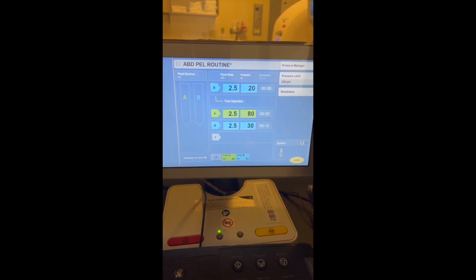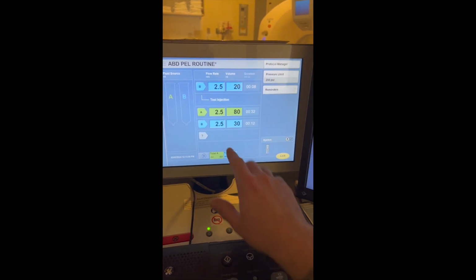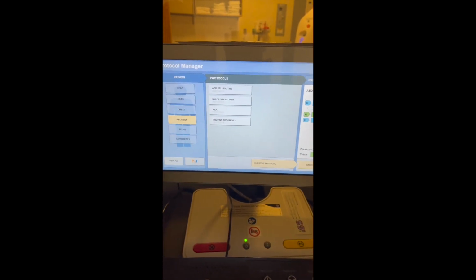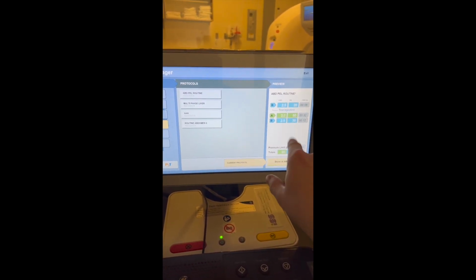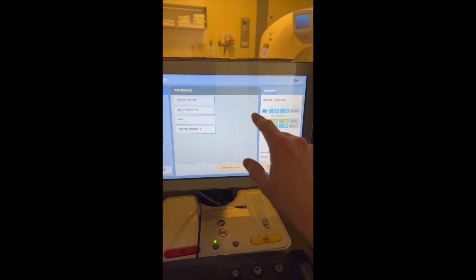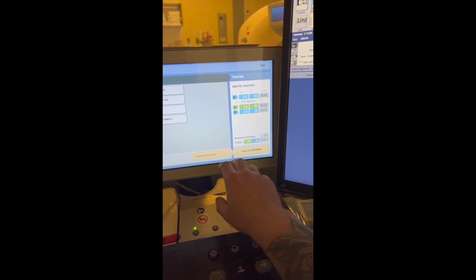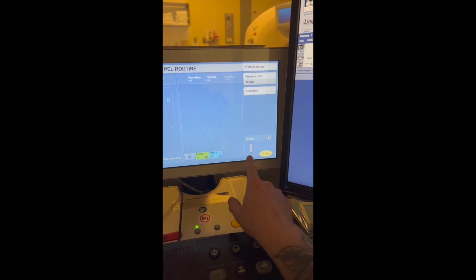Alright, so today we're talking about the Bayer pressure injector that's used for CT. Just a little thing, if you want, come up to the protocol manager. Usually the place will go ahead and have all your protocols set up. It'll tell you how fast you're scanning, you'll have your contrast, you'll have saline, contrast, and then saline again, and it'll tell you about how long it'll take. And once you click the one you like, you can click OK.